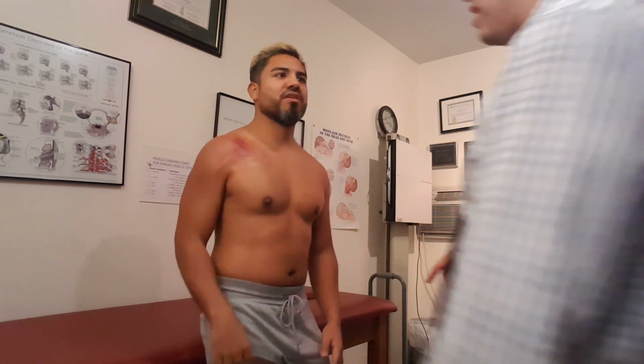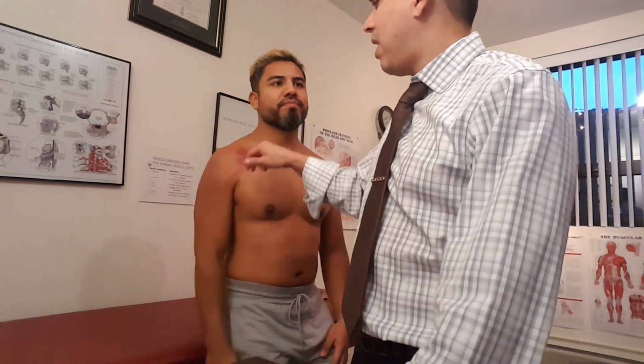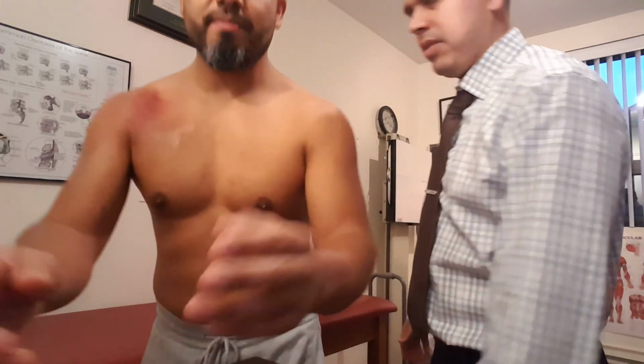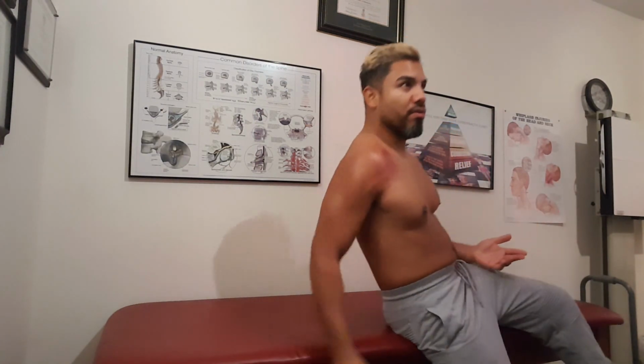I can already see. You also have to know when to stop this therapy. All right. So right now, okay. It's not how long you do this therapy. It's the reaction of your skin. Wow. So I also pay attention to that when I'm doing this kind of therapy. So lay on your back. Okay. This is why it may take time to heal. That's right. Okay.